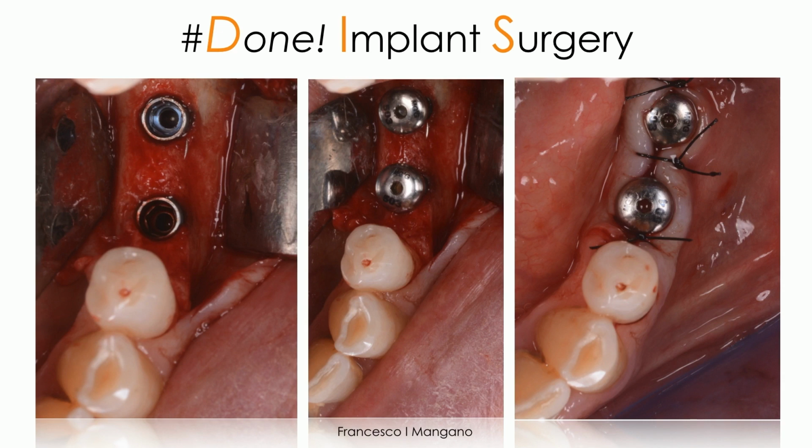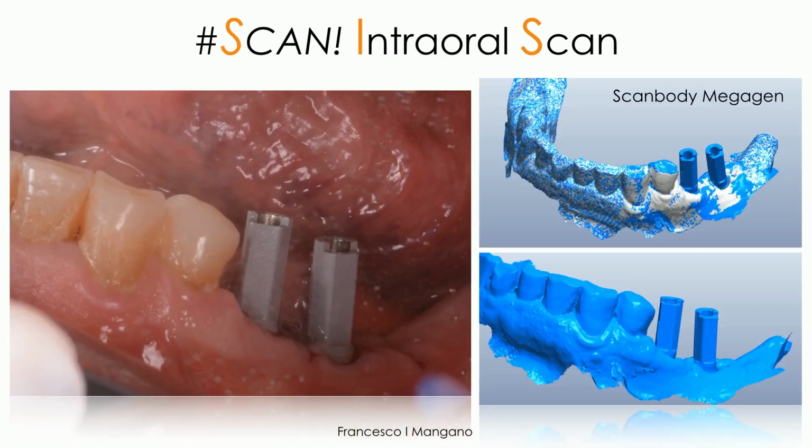So it's not a fully guided surgery, it's an assisted guided surgery, because the last step, the placement of the implant, can be done manually without any guide, not through the guide. It's my decision, because I don't like the idea of having a contact between the guide and the surface of the implant. That is obviously a very valuable tool for the osseointegration, and we don't want to contaminate it in any possible way.